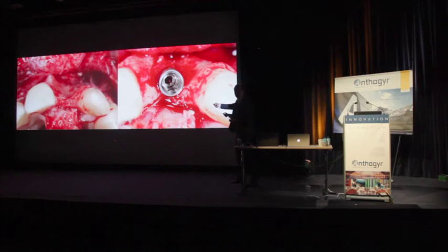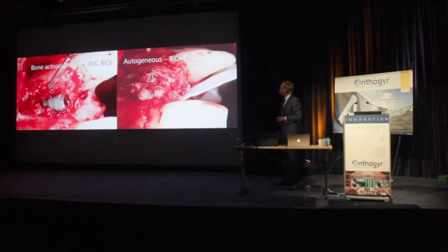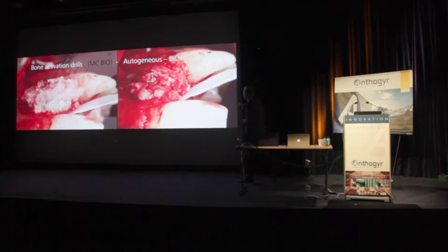Is it clever to have a cover screw covering the neck of the implant, not only the connection? The whole neck, it looks quite white, this connection. But let's see what's happened. I have now my regeneration. I still use membranes, some biomaterial. Bone techs, 7 months later, the bone is back.